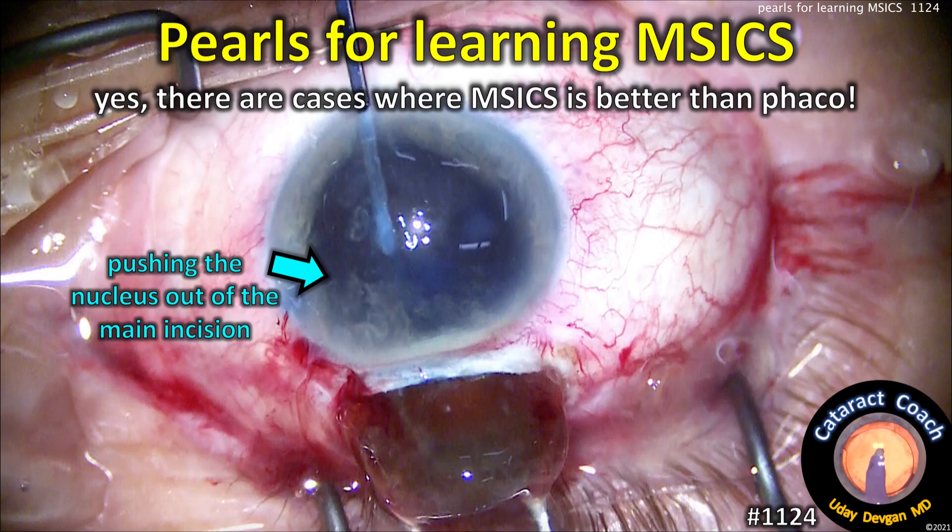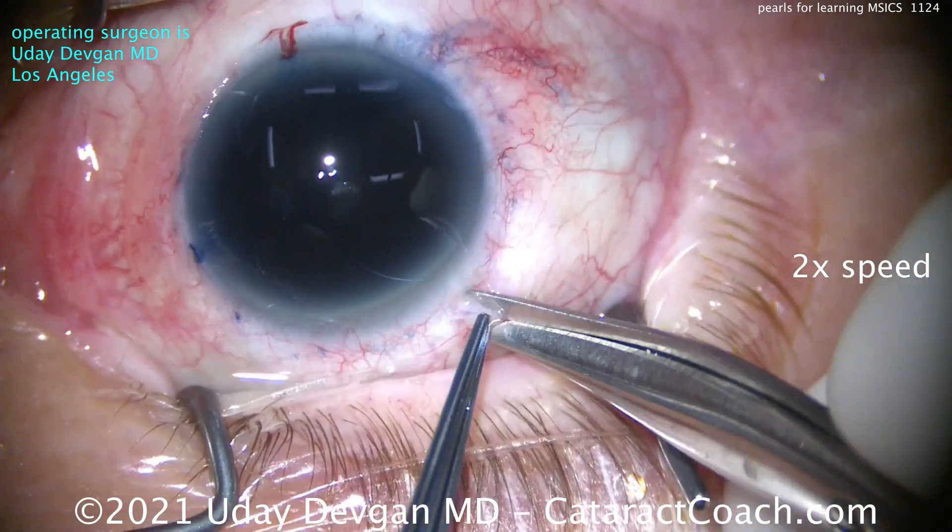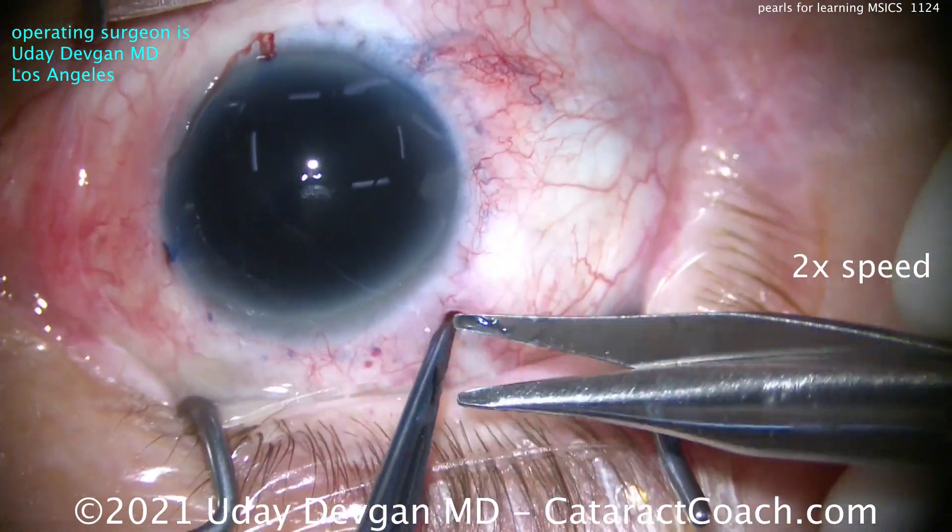cataractcoach.com — pearls for learning MSICS, manual small incision cataract surgery. And yes, there are cases where MSICS is better than phaco, and here's one of those cases. We're going to speed the video up here just to get through the important parts.